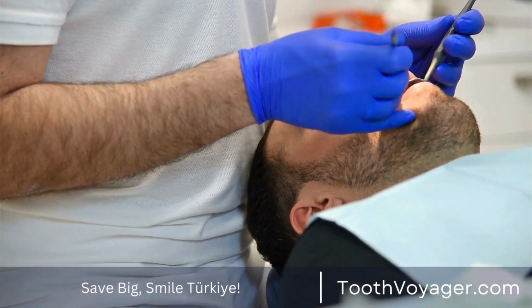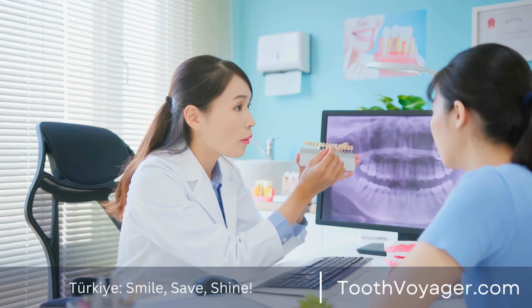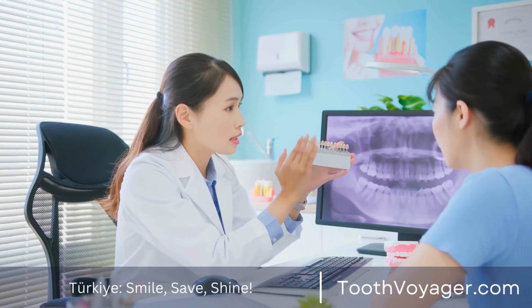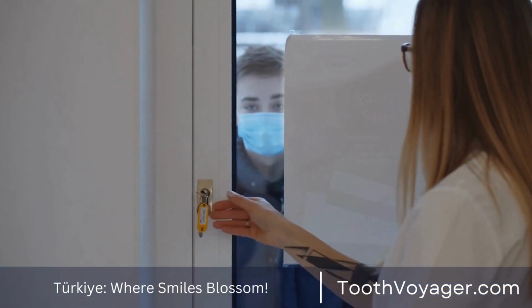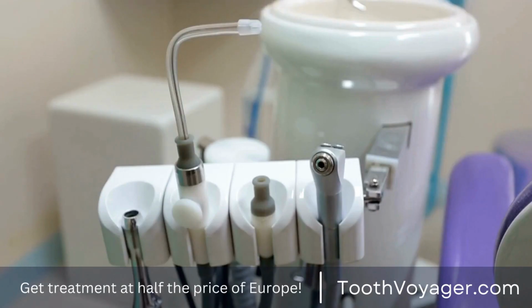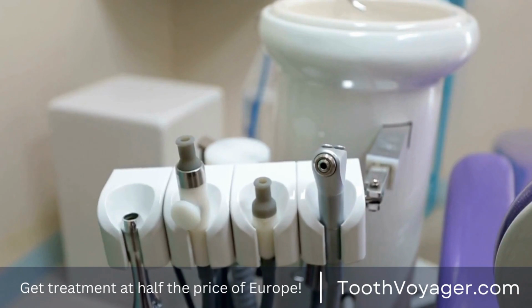The final dental restoration is made to fit the individual's teeth and create a smooth and natural-looking smile. Aftercare. Once the final restoration has been attached, patients will have to take care of the dental implants for their long-term health. It could mean periodic dental cleanings and checkups and proper oral hygiene at home.